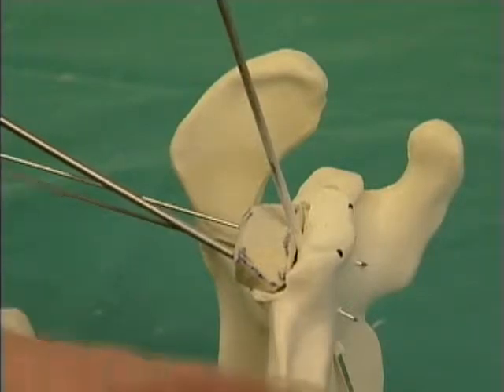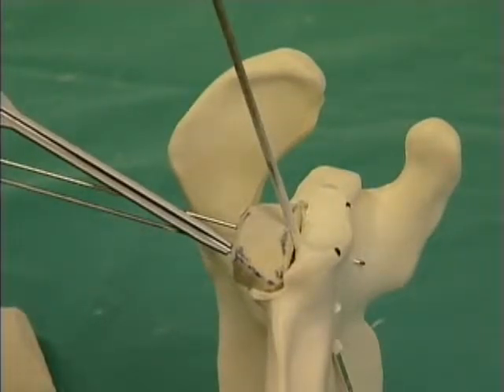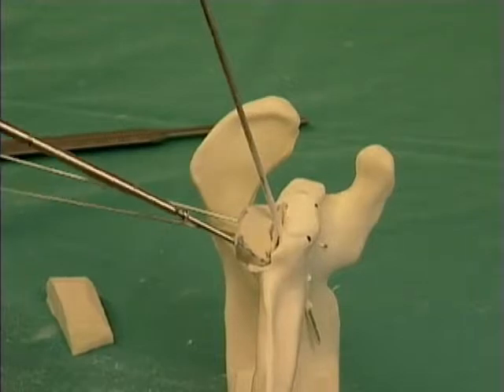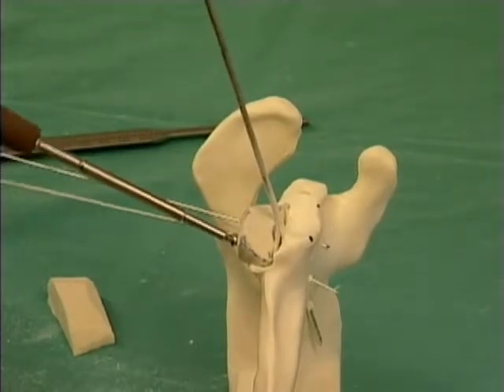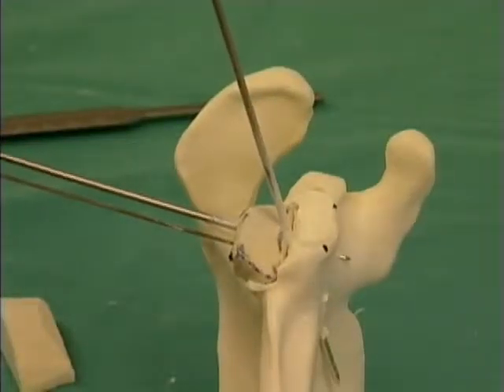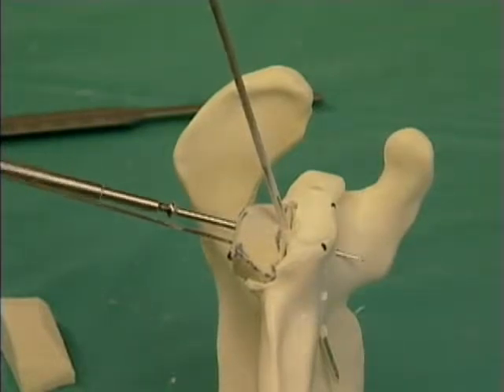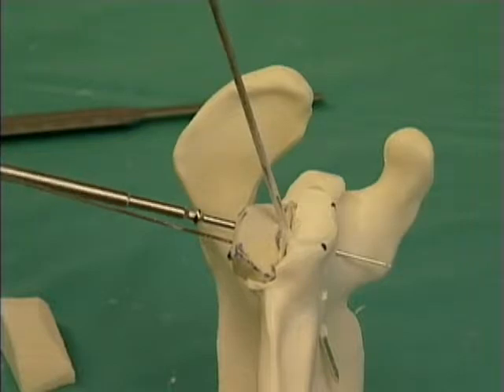The guide pins are reamed with a cannulated drill, the length of the screw measured, and two cannulated 4.0 screws are placed through the superior and inferior guide pins. When placed from posterior to anterior and contacting the anterior cortex, they result in compression of the graft within the step cut of the glenoid. This provides a very stable graft construct for support of the glenoid component.